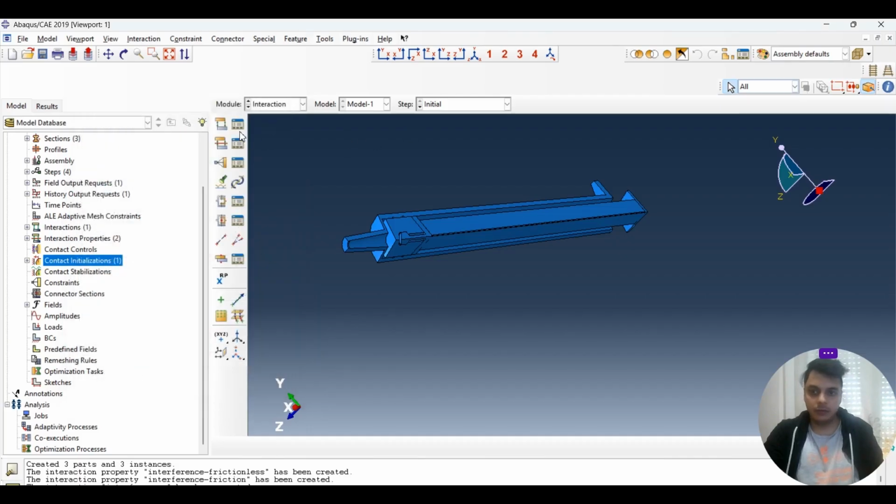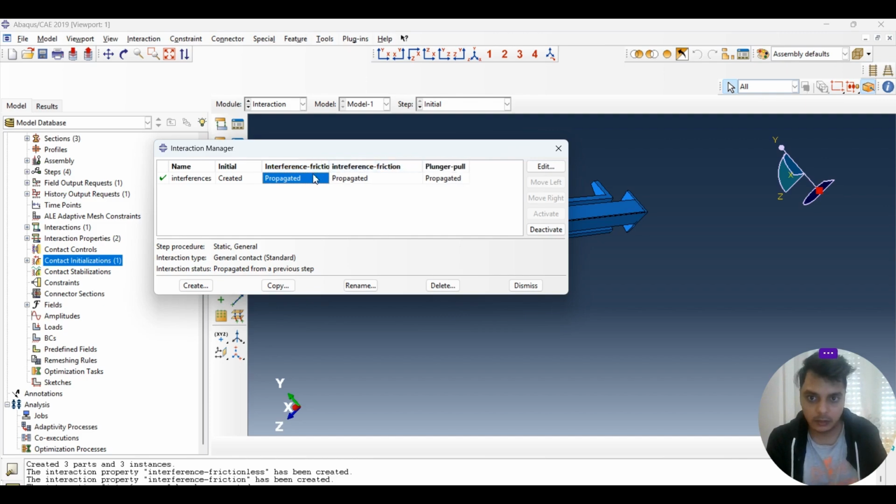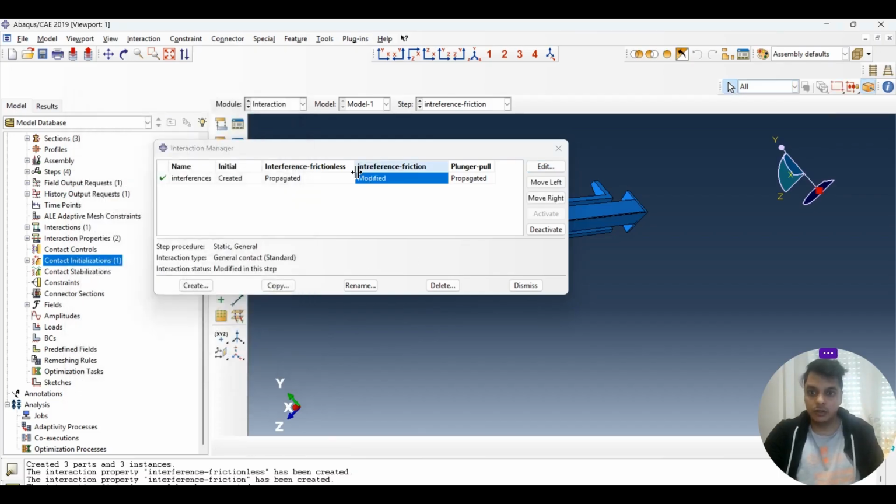Now what we have to do, we have to go to the manager. Interference for the initial step, if I try to make it longer, so initially it is good, I have a frictionless, but I have defined another property that makes more sense to put it here, so modify this particular step in interference friction to give it the friction values. So we go to edit and we just change it from here to the friction. That's it. So this is what we have managed, and this is how it's propagated.